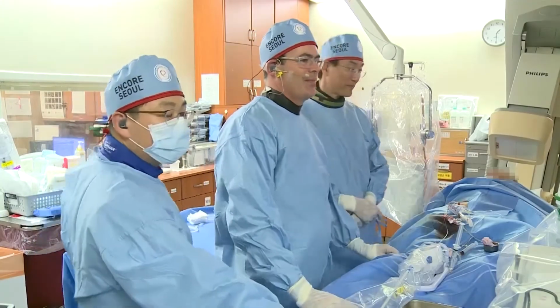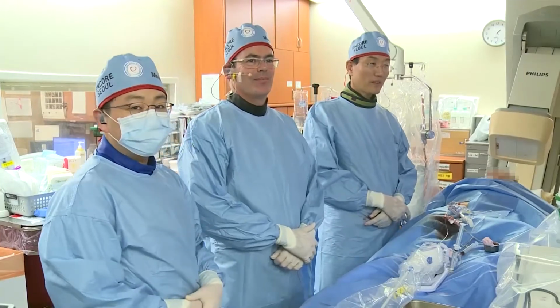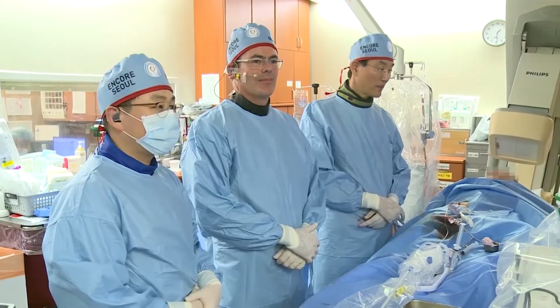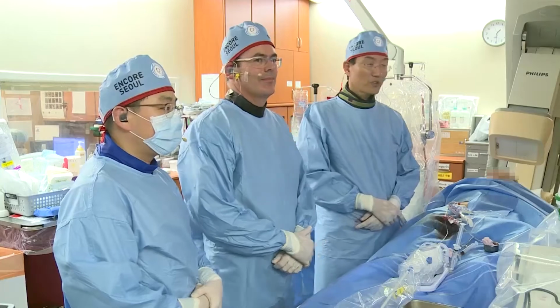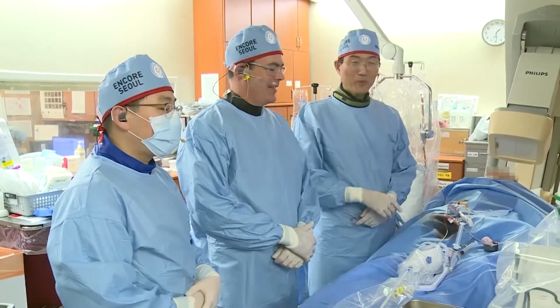We are on? Yes, Dr. Kwon, you are live at the coronary theater. Are you ready to introduce your team and present the case? Yeah, I'm just doing the IVUS pullback speed. So, okay, let it pull back.